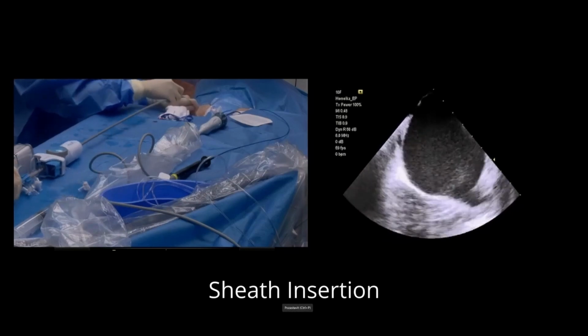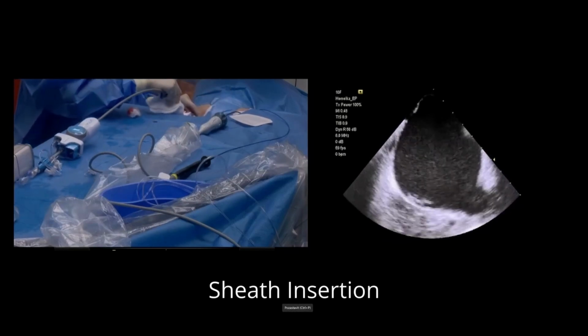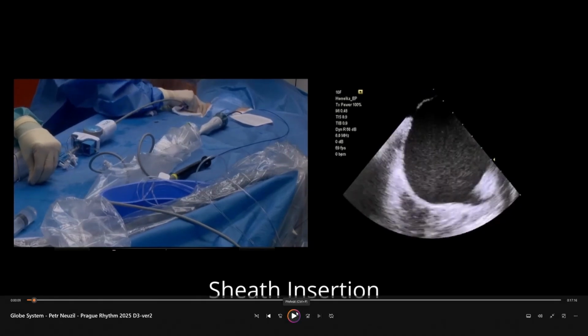As I mentioned during my presentation, the prepping of the sheath is very important. I will stop for a while. If you consider the sheath here, the surface is very nice because the hydrophilic coating works very nicely.